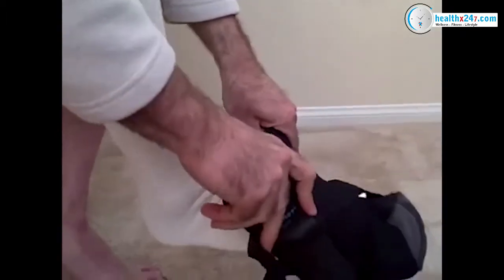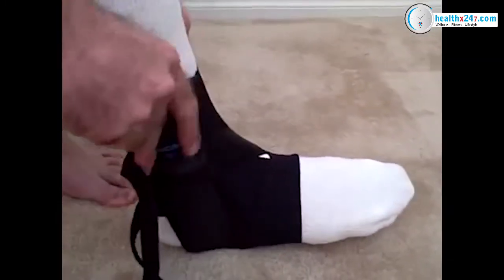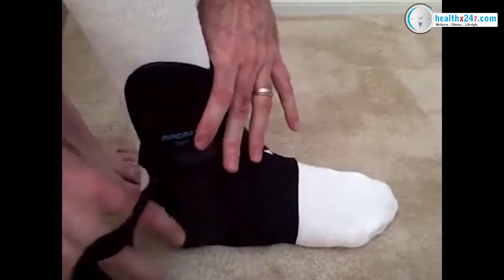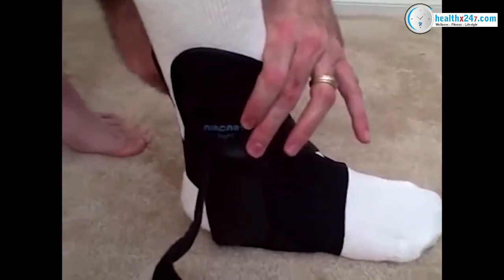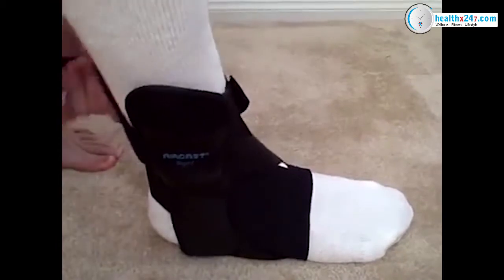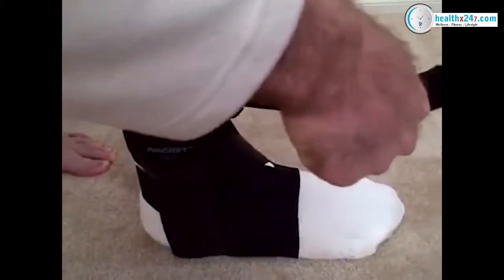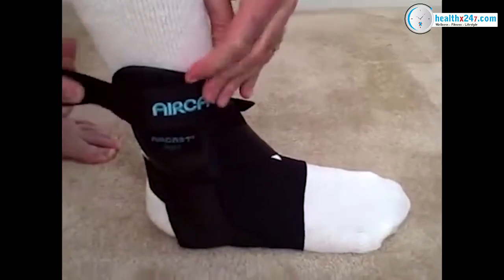I'm going to slip into it basically like a sock and get it situated perfectly, and then I'm going to close it off around the back with the first strap. And then I'm going to go ahead and start closing it off here just like so.